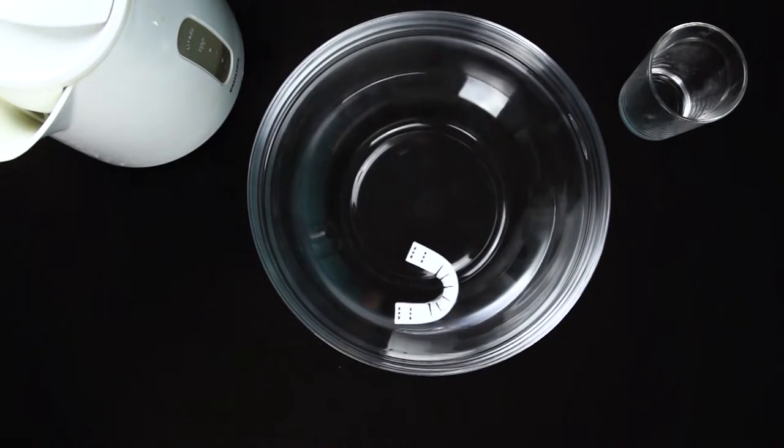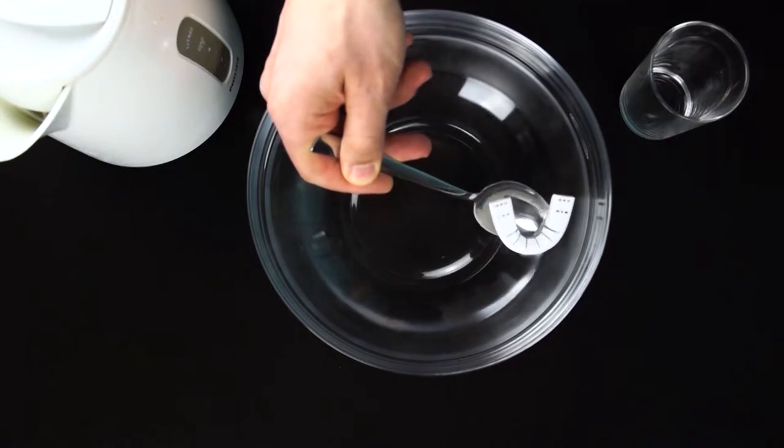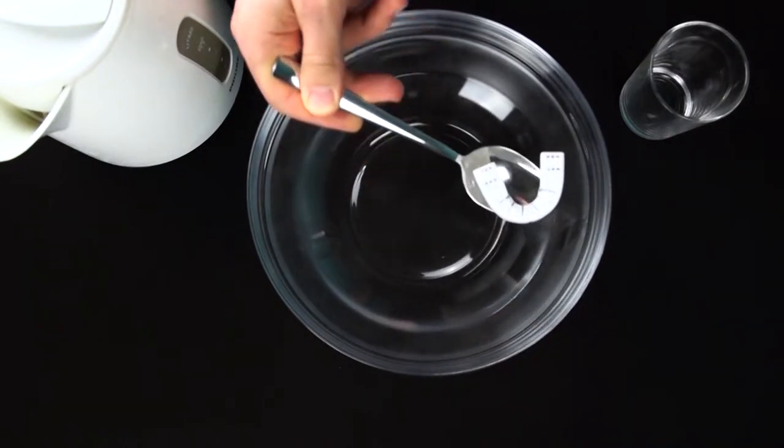Afterwards, carefully remove the dental guard from the bowl. Preferably use a spoon to slowly ease it out of the water from beneath. Make sure you drain all the hot water from the dental guard.